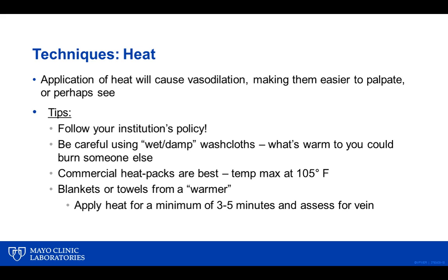Heat can be your best friend out there. You apply heat, the vessel will pop up. A lot of times you don't even see it or feel it. You apply heat for 3 to 5 minutes, and the vessel will pop up for you. You've got to follow your institution's policy on this. Like here at Mayo, we can't use warm washcloths or towels, things like that. We have to use heat packs, warming blankets. It has to be a controlled heat.